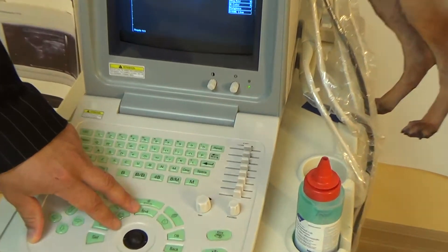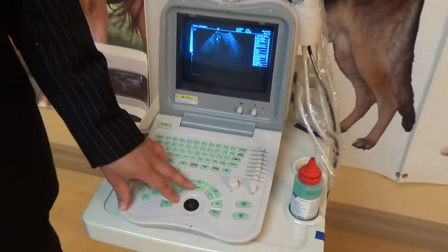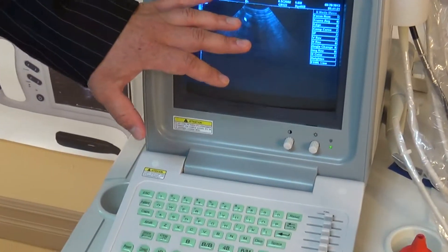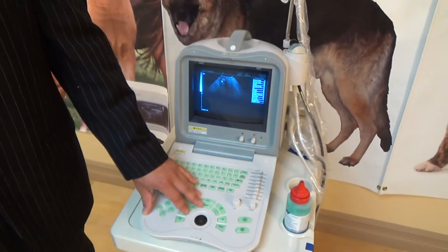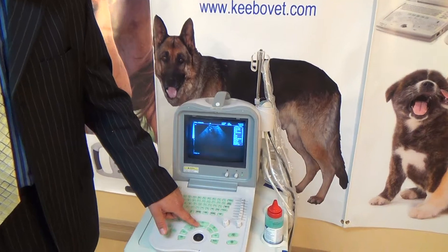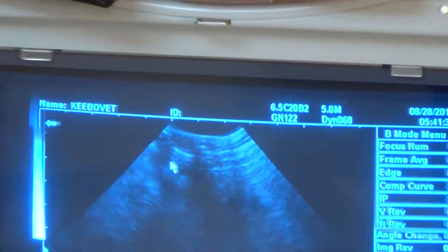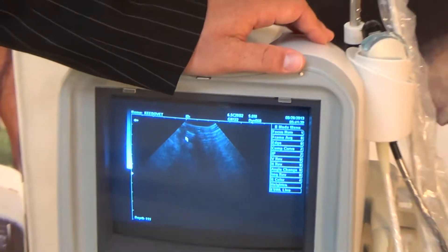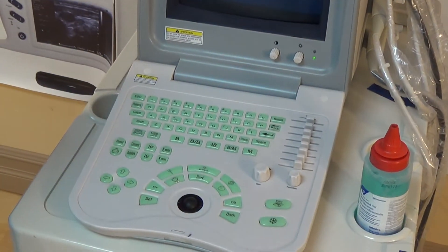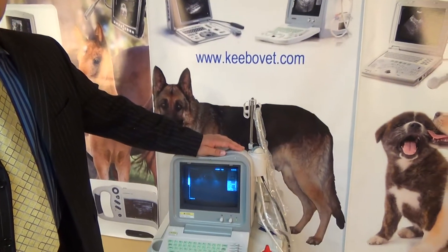Moving along, right under that there's a wave with an F, and that adjusts your frequency. Frequency is used to change the quality and resolution of the image, as well as how deep we can see within whatever we're scanning. The higher the frequency, the better the image quality, but the less depth we can see. If we decrease the frequency, we can see further; however, our image quality slightly decreases. The lower the number, the lower the image quality, but the deeper you can see.